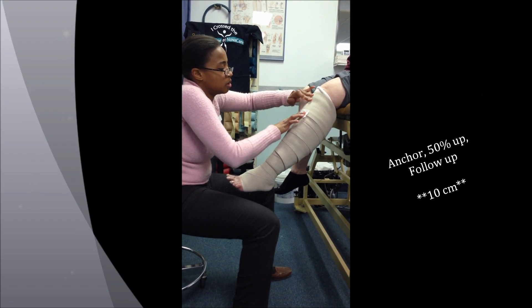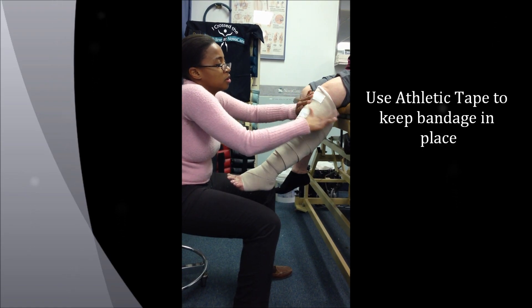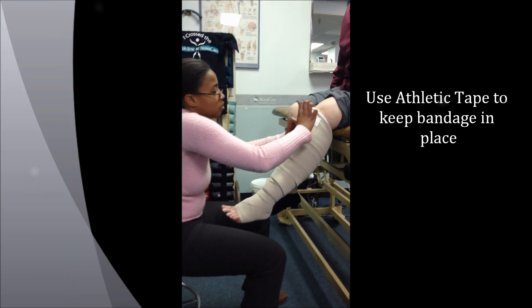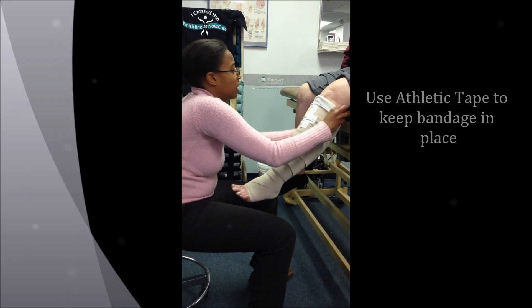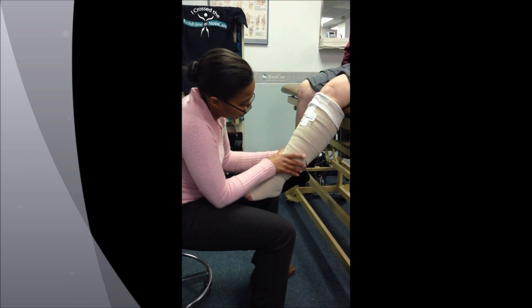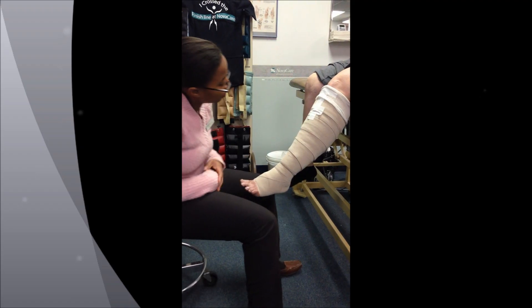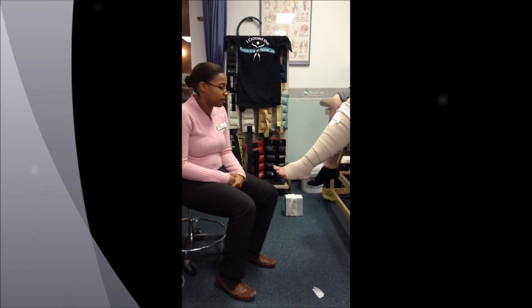Once the last one is on, put a good anchor with the tape, put that excess, bring it down. Make sure all your spots are nice and smooth. That is the lower extremity wrapping to the knee.